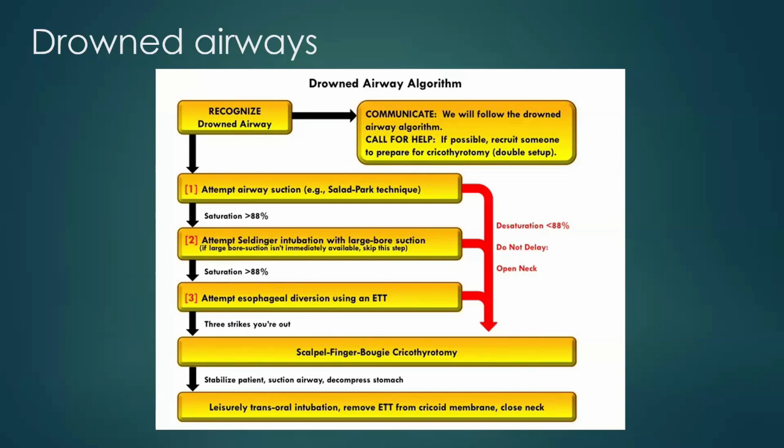You hold it in the same hand as your laryngoscope, or you ask someone else to bring it in from the left-hand side. Don't bring it in from the same side as your tube because once again, space is limited, especially in children. So it's important that if they're coming in from the left-hand side with your laryngoscope, that space is dedicated to the suctioning, and then you have all the space on the right to maneuver and manipulate your bougie or tube as needs be.